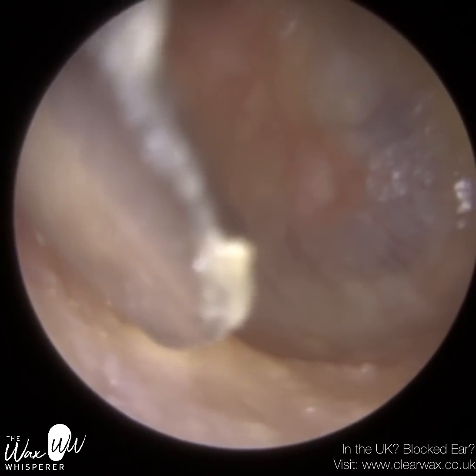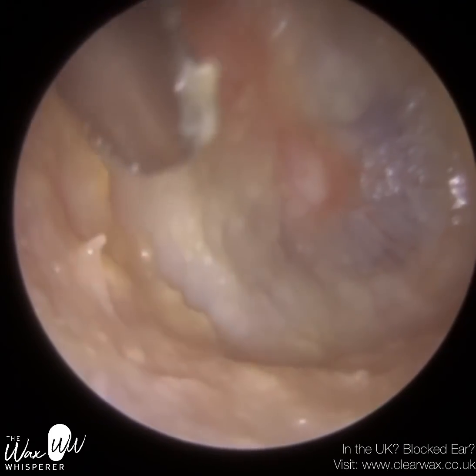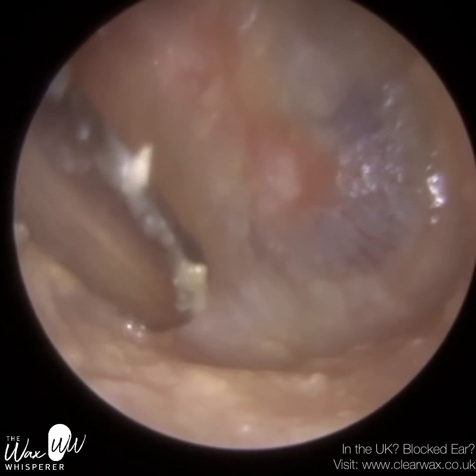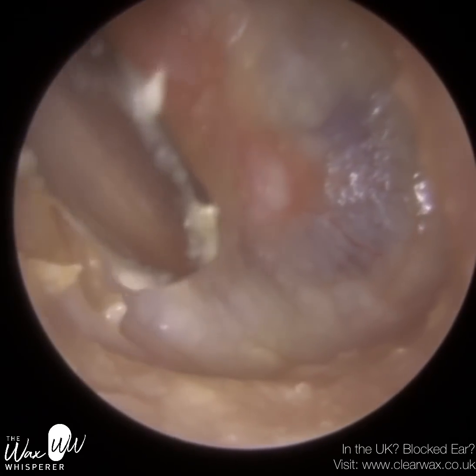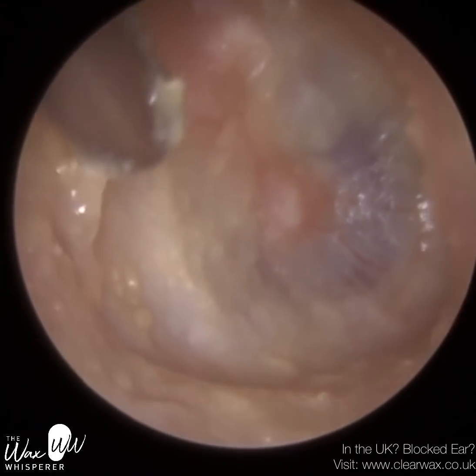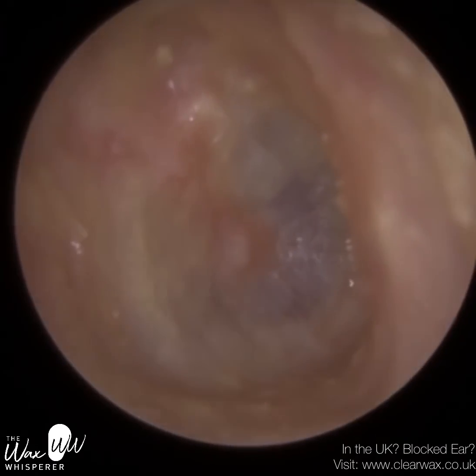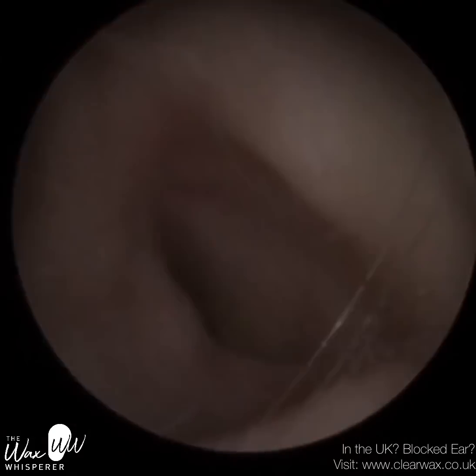Now you can see the majority of the eardrum there already. You can see the hammer bone in the centre. Where I am now, there's some scar tissue here on the patient's eardrum. It's slightly opaque. This type of discharge is quite difficult to suction at times. It's quite gloopy and glutinous. We can see that beautiful view of the eardrum now. I'm really pleased with that, especially considering how their ear was when they first arrived.